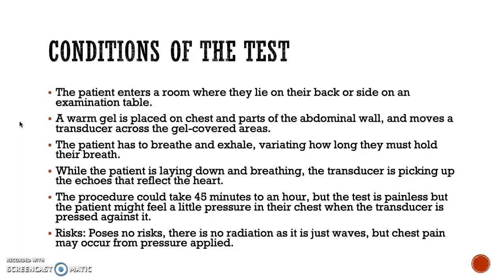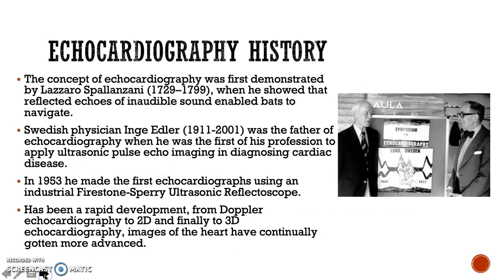The procedure could take 45 minutes to an hour, but the test is painless, and the patient might feel a little pressure in their chest when the transducer is pressed against it. So the risk for this, since there's no radiation and it's not invasive, this doesn't pose any risk to the patient besides chest pain if they're really sensitive in their chest region, because there's slight pressure applied. But other than that, there really is no risk involved in the procedure.